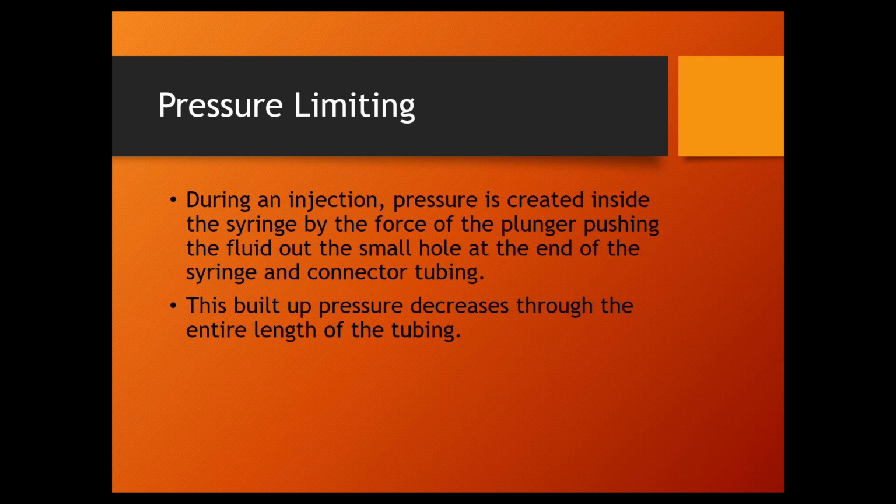Then the other thing they select is the volume. So we picked how fast we're going to inject it. Now we need to decide how much we're going to inject into the patient, and it can be anywhere from 10 to 100 milliliters, if not a little bit more. Those two are obvious.